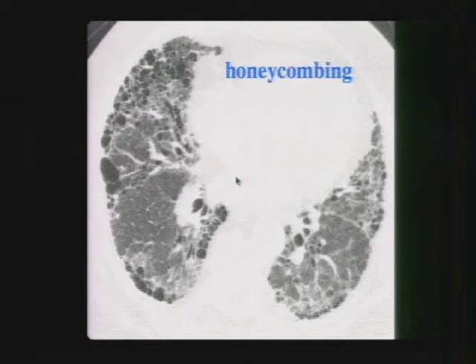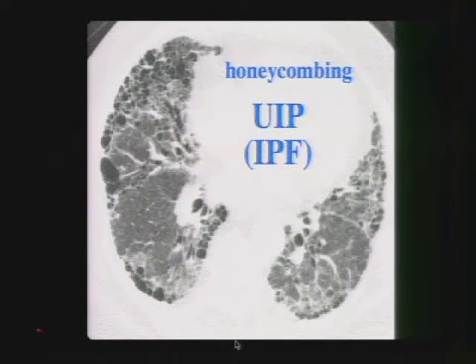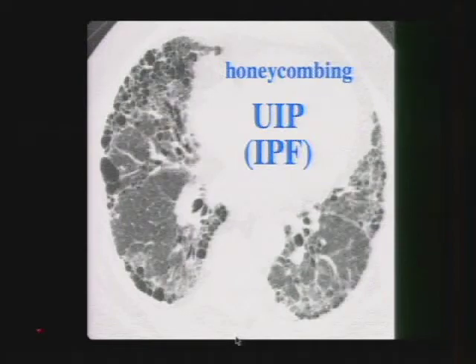The second finding to discuss is honeycombing. We see cystic areas of lung destruction in a subpleural location — you must see these black holes in a subpleural location to call it honeycombing. This patient has the most common cause of honeycombing: usual interstitial pneumonia, or UIP, with the associated disease being idiopathic pulmonary fibrosis, or IPF.